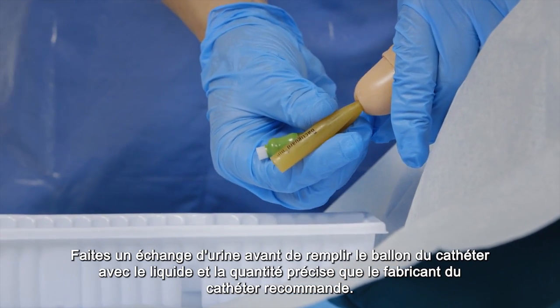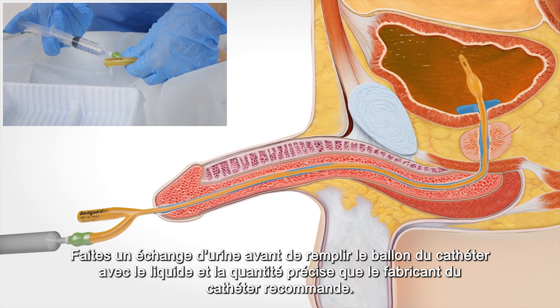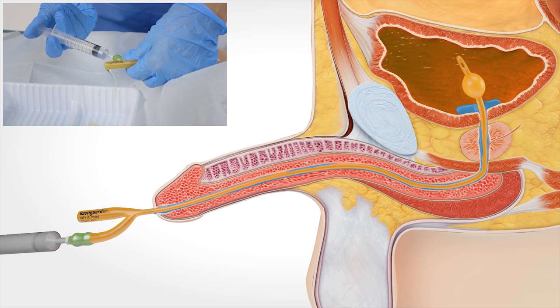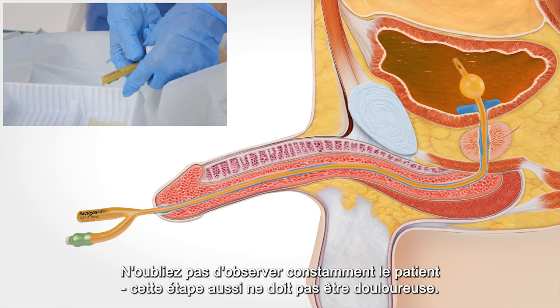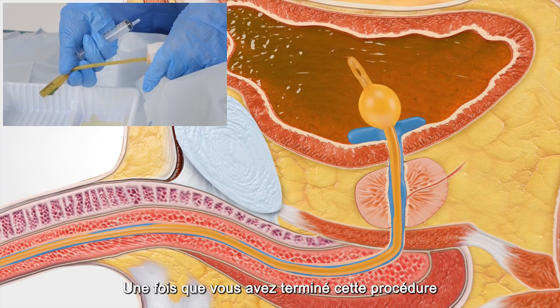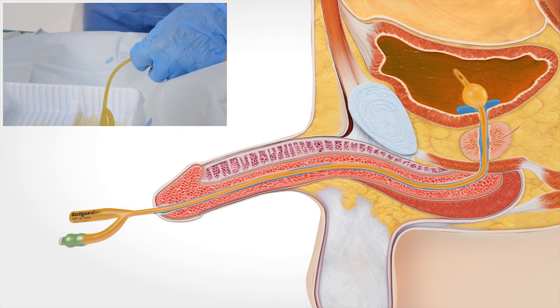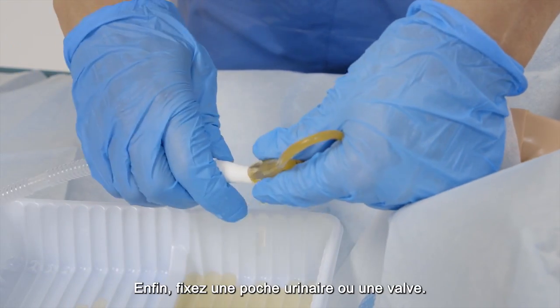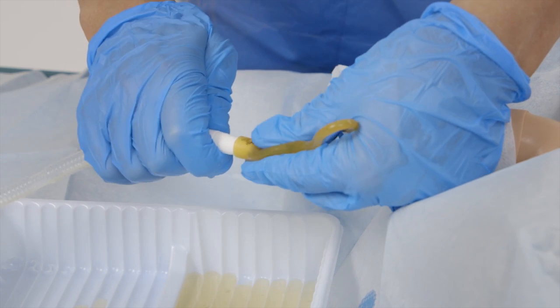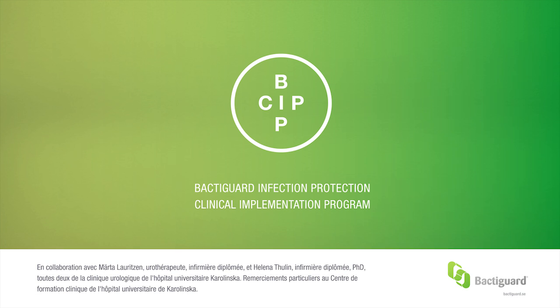Get some urine in exchange before you fill the catheter balloon with the fluid and precise amount that the catheter producer recommends. Remember to constantly observe the patient — this step also shouldn't hurt. After you have completed this procedure, make sure that the catheter is positioned correctly and can move freely. Finally, attach a urinary bag or a valve.